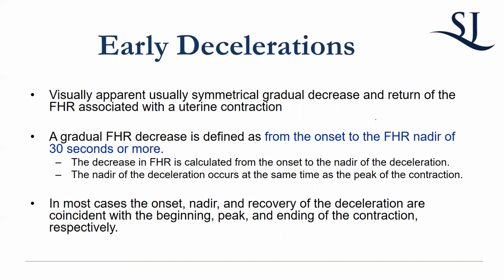So accelerations, obviously, if they're there, they're good. There's never a situation where an acceleration is bad. The only exception is if you accelerate into fetal tachycardia and it stays there, then it's not an acceleration anymore, is it? But good questions.